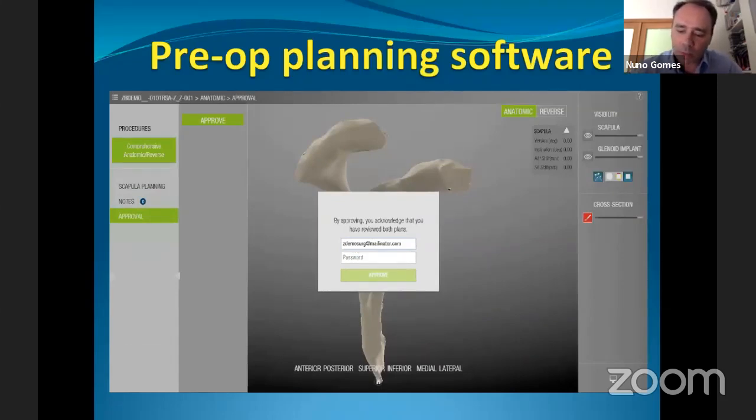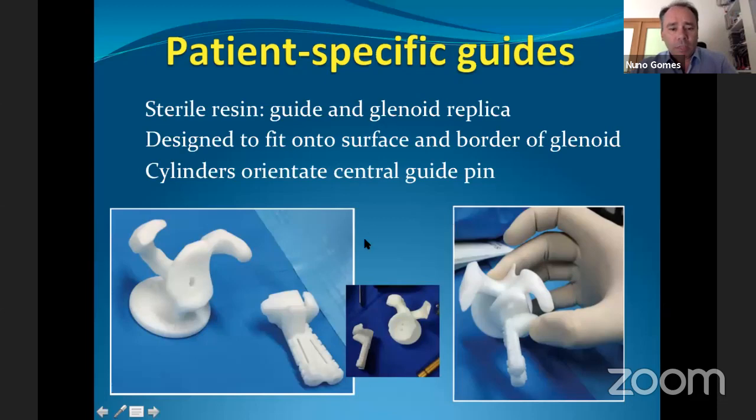The company builds a sterile resin guide — or some hospitals can make it themselves — along with a glenoid vault replica that helps you compare it with the native glenoid. The guide has two tunnels: one for the reverse and one for the anatomical prosthesis, allowing you to choose between both. It's designed to fit on the surface and border of the glenoid.